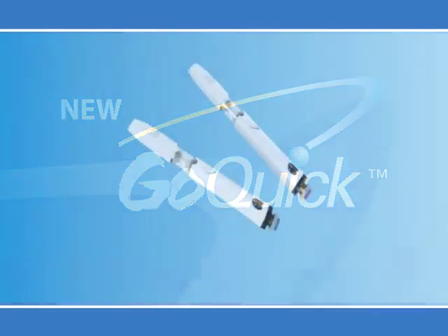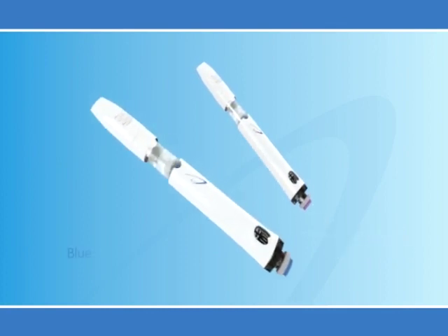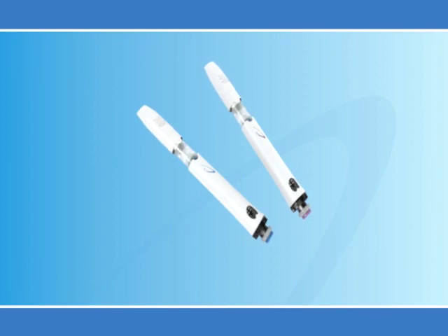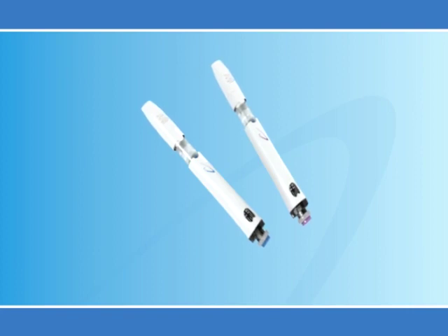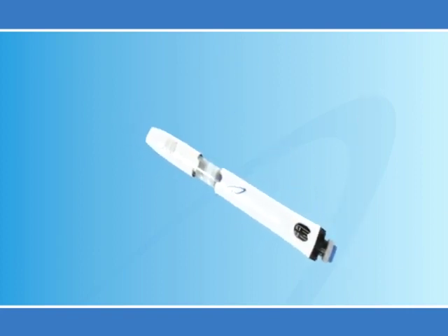The Go Quick Pen comes in different colors to represent different strengths. The Blue Pen is 5.3 milligrams, or 16 international units, and the Purple is 12 milligrams, or 36 international units. Your doctor will give you the pen with the right strength for you. All pens are used and prepared the same way, but today we'll use the Blue Pen to demonstrate both the initial setup and everyday use.